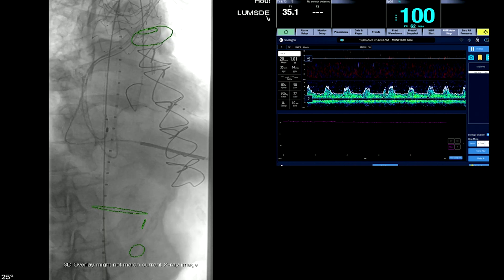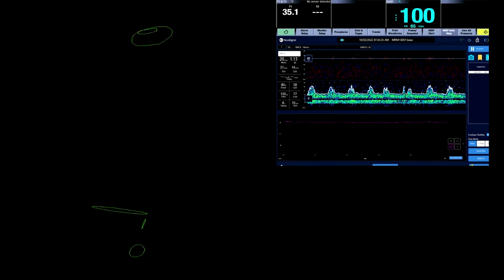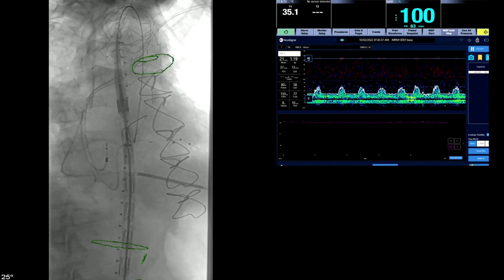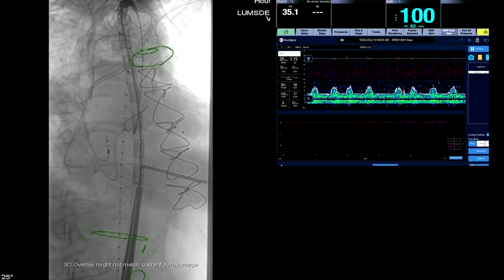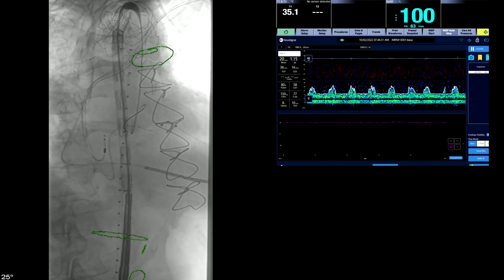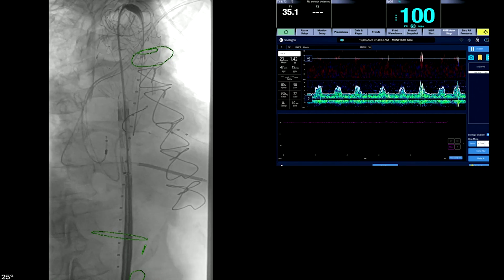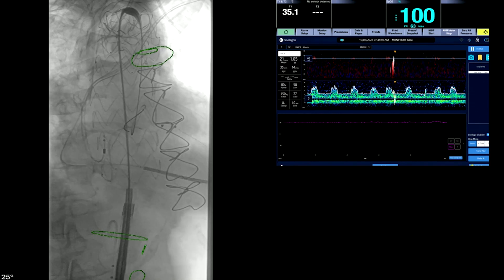The primary device is going to be removed and the secondary device brought up into place. Again at this point, no evidence of embolization. Note that this video has been sped up about 300% — we're not quite this aggressive in moving the devices in real time. The grey pusher rod is a little short of the device and needs to be brought up into position. We're bringing the bottom end of the device down to deploy the graft just above the celiac. The second device is being deployed and the delivery system recaptured.